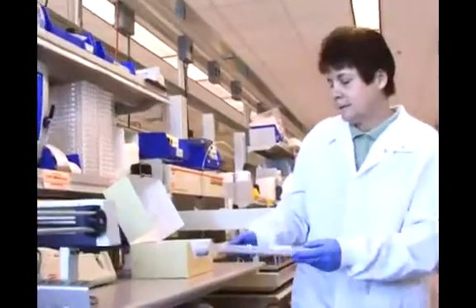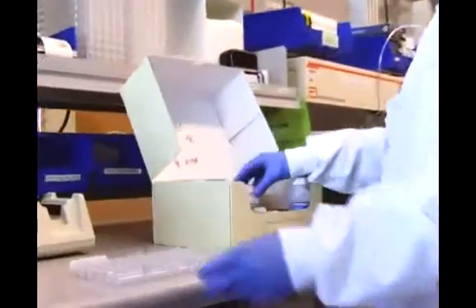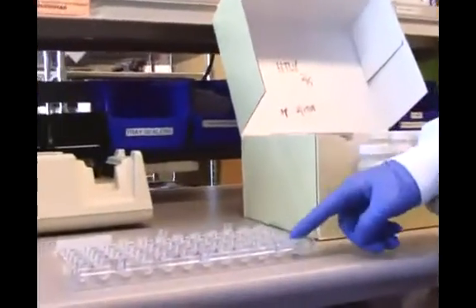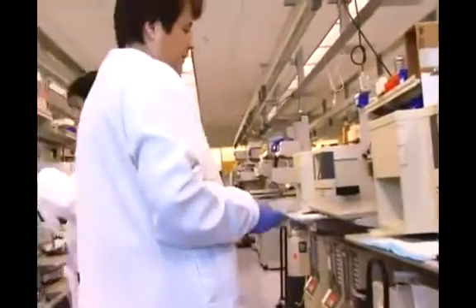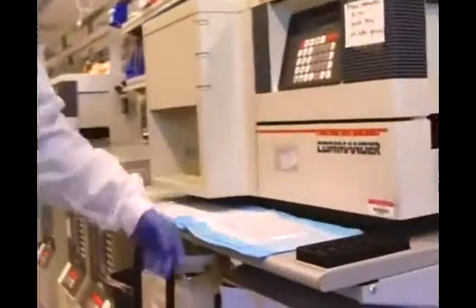Once it's all been pipetted, the beads I talked about are going to be added into each one of the wells. Then this tray is going to be incubated in an incubator.